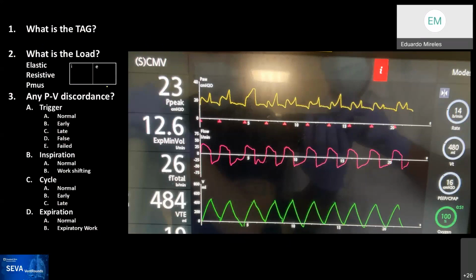So this is CMV, and in this ventilator SCMV. You can see how challenging it can be, just walking by, to ask what this means and what the mode is. By knowing that on this ventilator, a Hamilton, this mode is essentially volume control, I'm going to walk you through it.